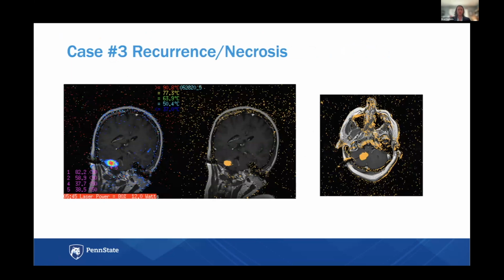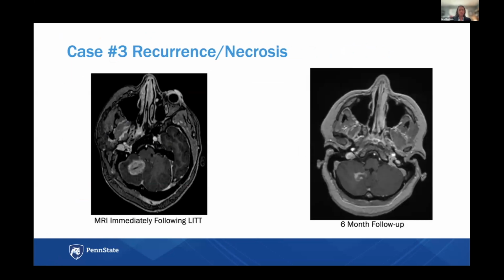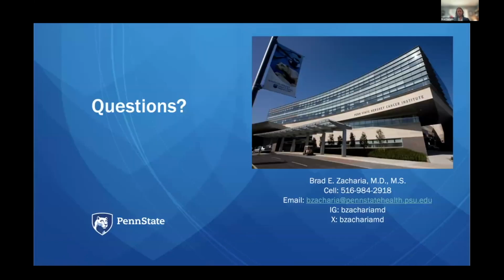You were able to get a nice ablation, again, with an overnight stay. This is that immediate post-operative image with that kind of eggshell enhancement. And then you see 6 months following. There's a little bit of a whirlwind, but I hope that gives you just an overview of the burgeoning role of laser ablation in the tumor world.